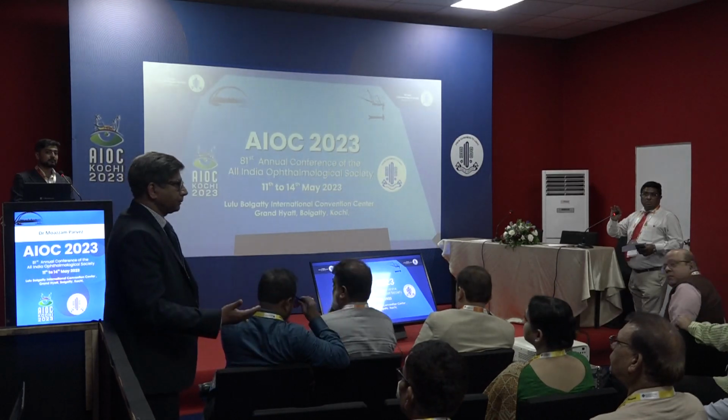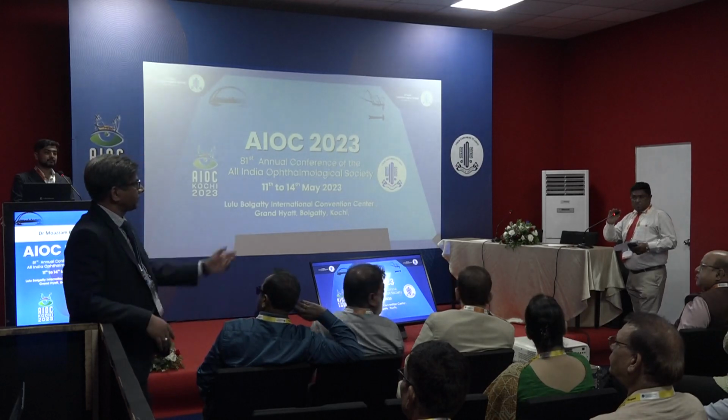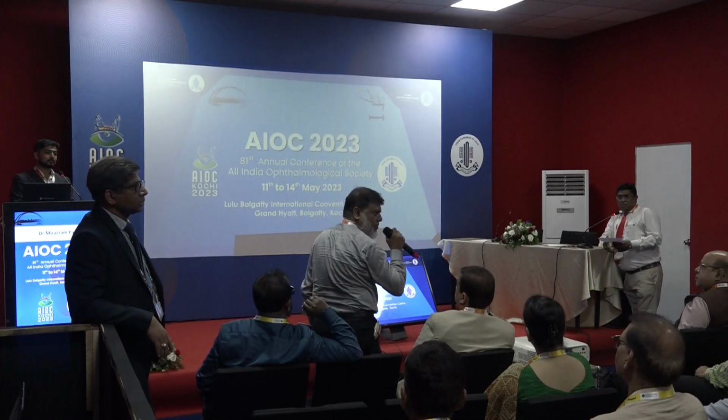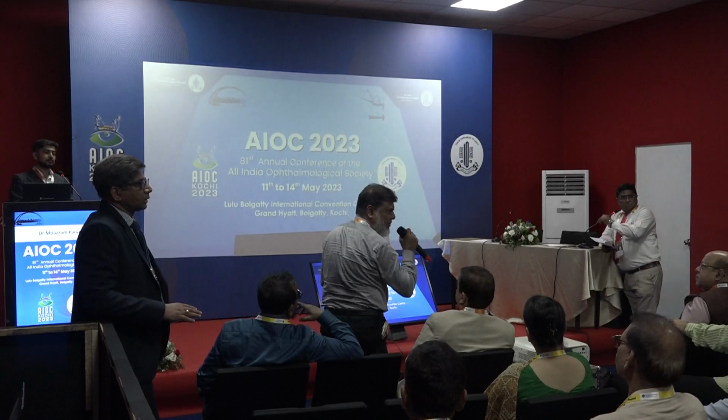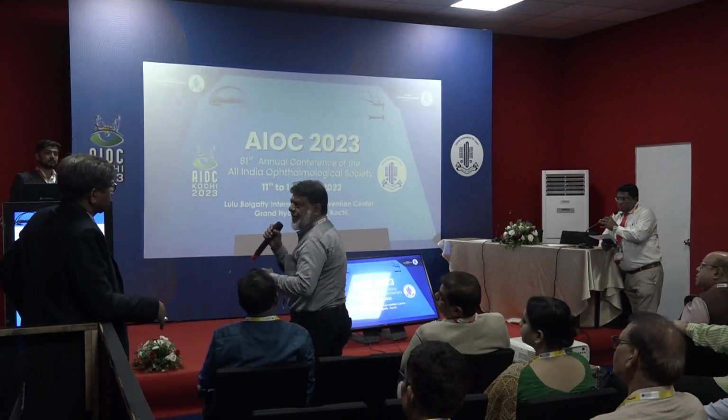If it is stable and if it's non-central, I think you should be able to deal. No, in keratoconus, it should not be done. Even early is not stable. It preferably should not be done.